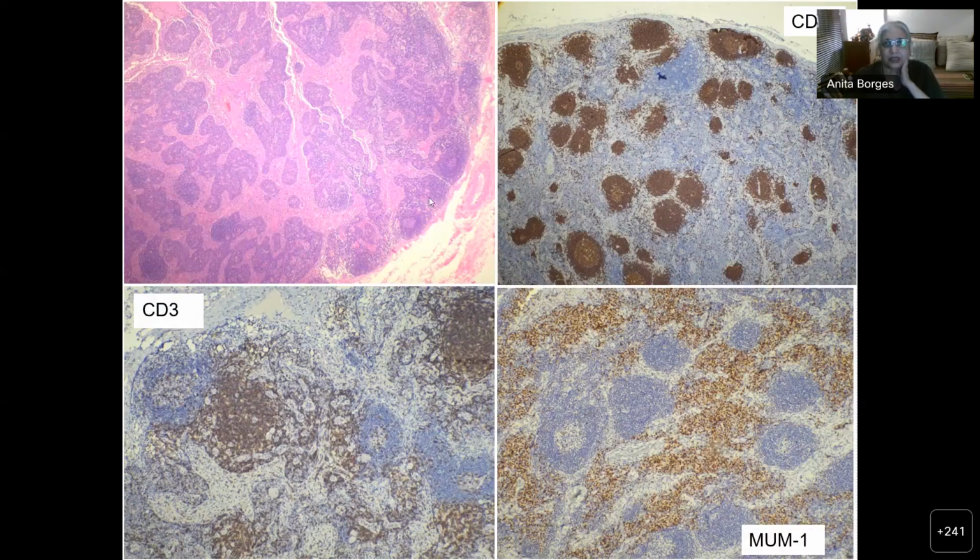You can see that it's here. And as I told you, it's not very easy to talk about the cortex and the medulla. Okay, where would you actually draw a line to say this is the cortex, that is the medulla, and in between is the paracortex? In fact, what you see, I hope that my cursor is visible. I'm not sure.